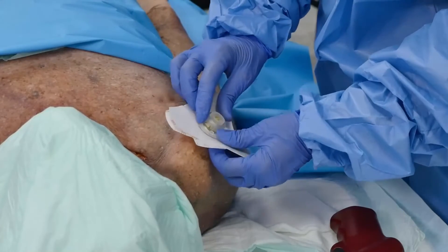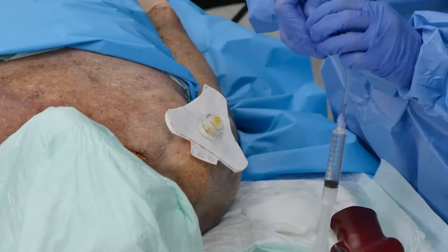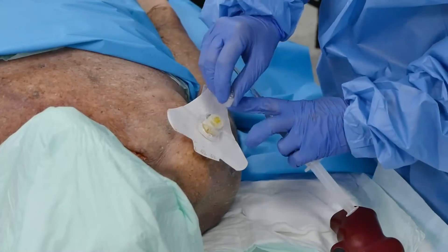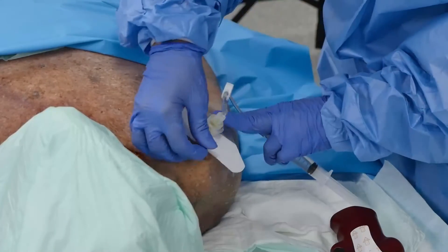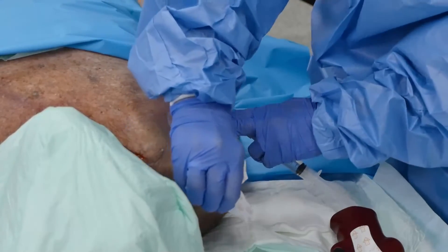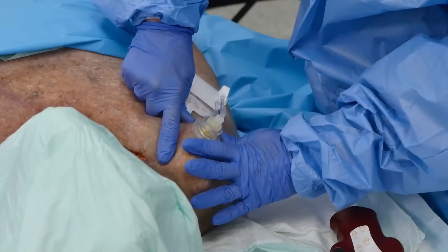Next I'm going to place my Easy Stabilizer dressing and then the Easy Connect. I'll pull the tabs securing my IO to the skin.